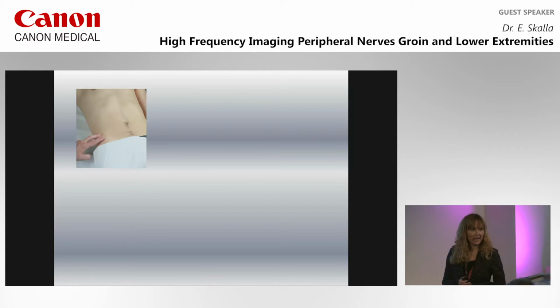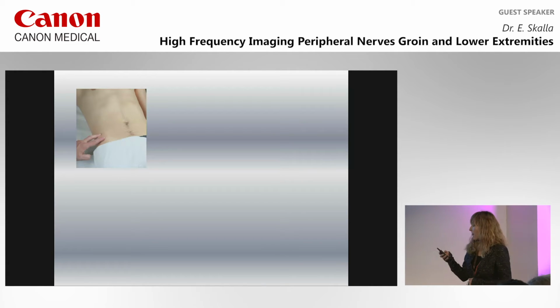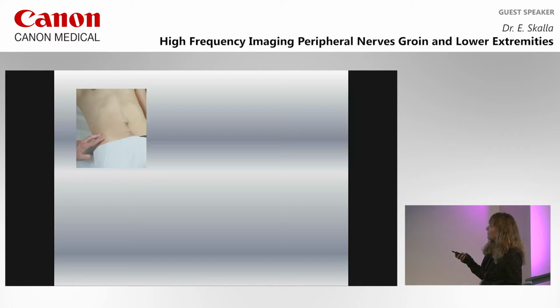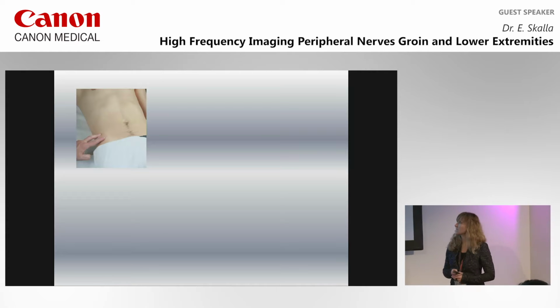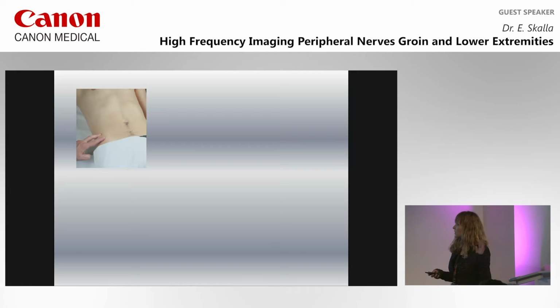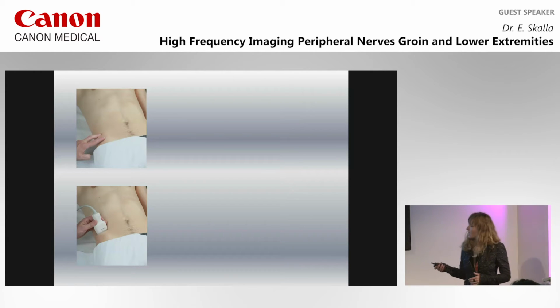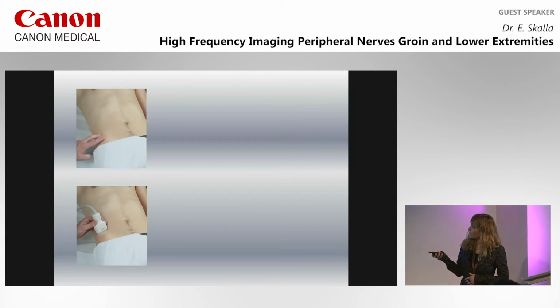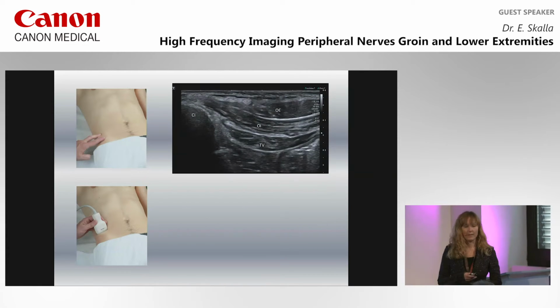So external landmarks are important to know where to put the probe for the first contact. In most patients, in some of them we have to palpate the anterior superior iliac spine. It's easy to find. And then we go 2 to 3 cross fingers proximal and dorsal to the spine. Put the probe in a perpendicular approach on the iliac crest. You see the lateral edge of the probe should lie on the crest. And then we get this picture. And now we can define our internal landmarks.